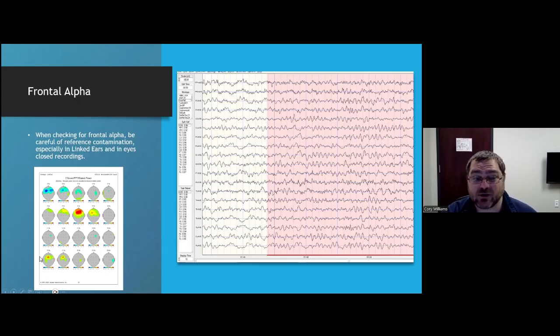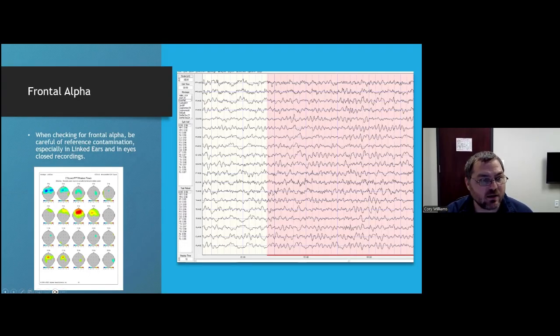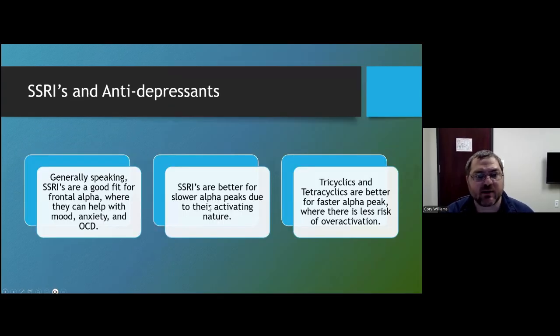So that's not frontal beta, that's a harmonic from frontal alpha. Okay. This will bring us into, oh, and sorry, one last thing. On our antidepressants, I'll go back to this one for a second.